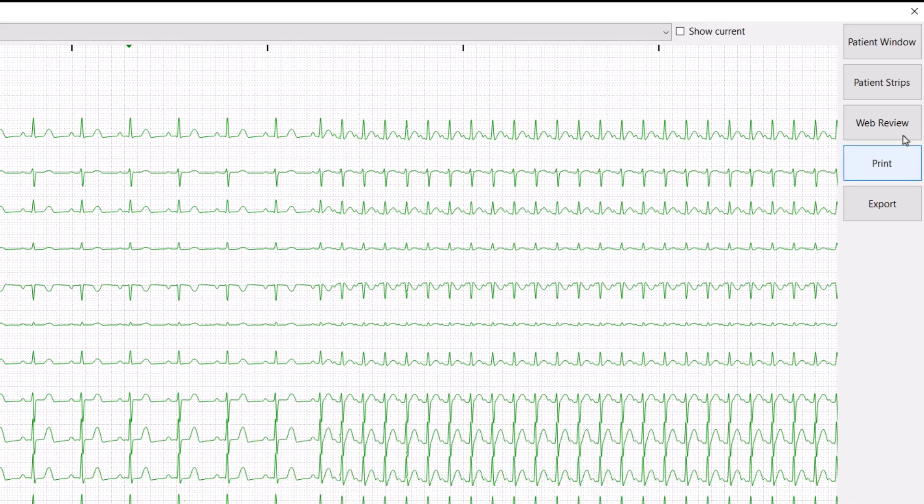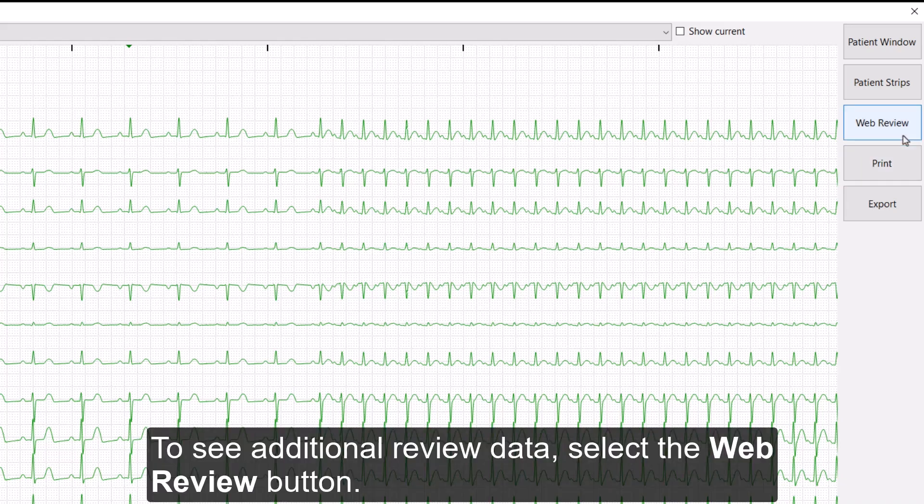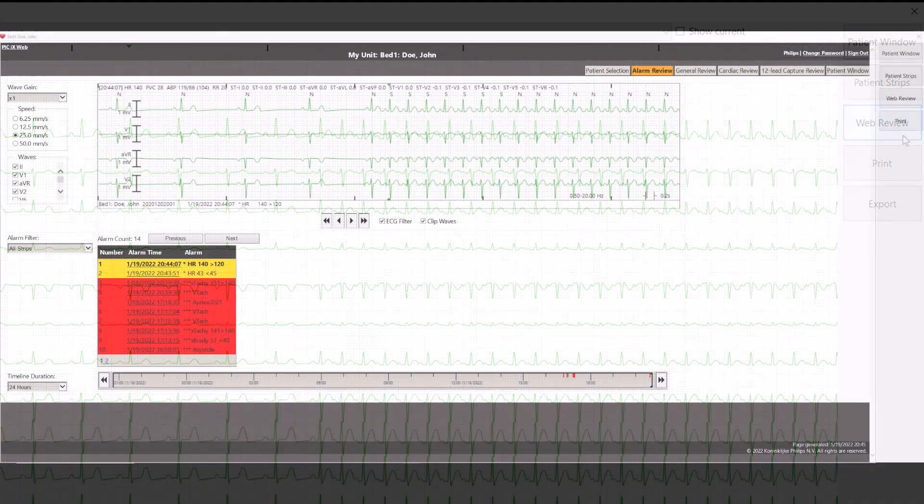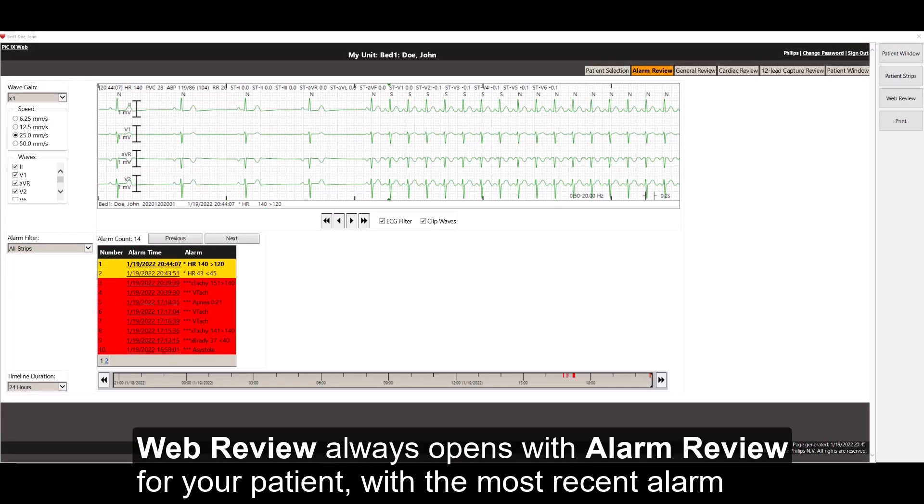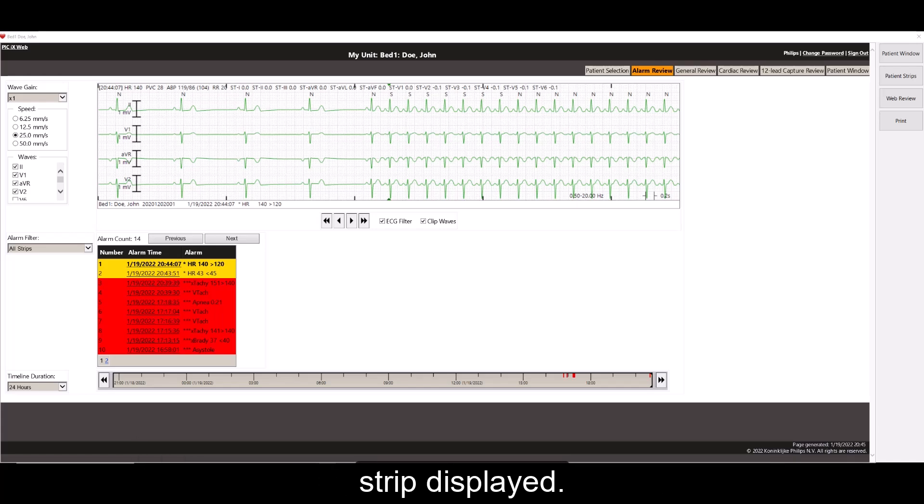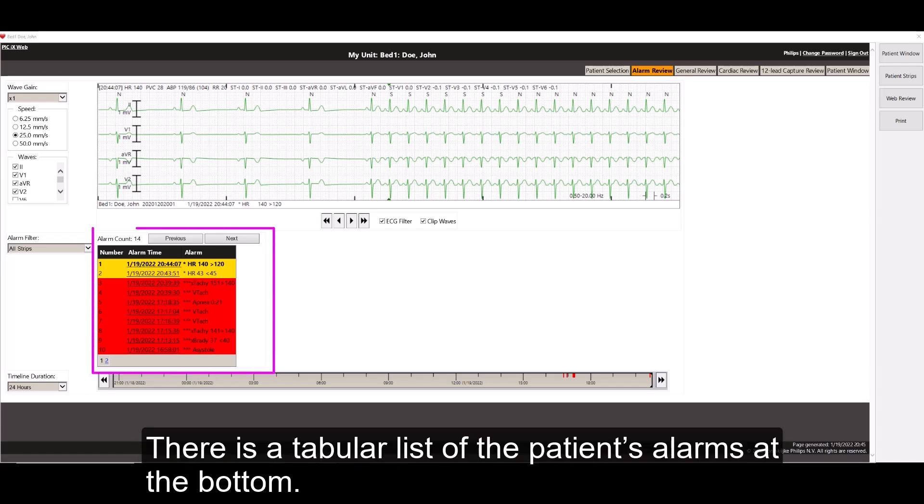To see additional review data, select the Web Review button. Web Review always opens with Alarm Review for your patient, with the most recent alarm strip displayed. There is a tabular list of the patient's alarm at the bottom.